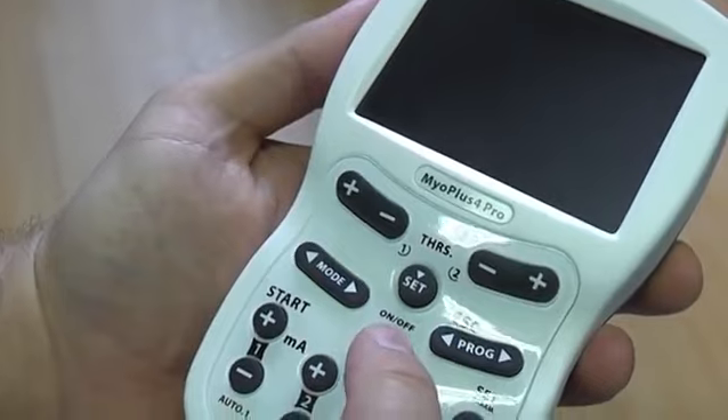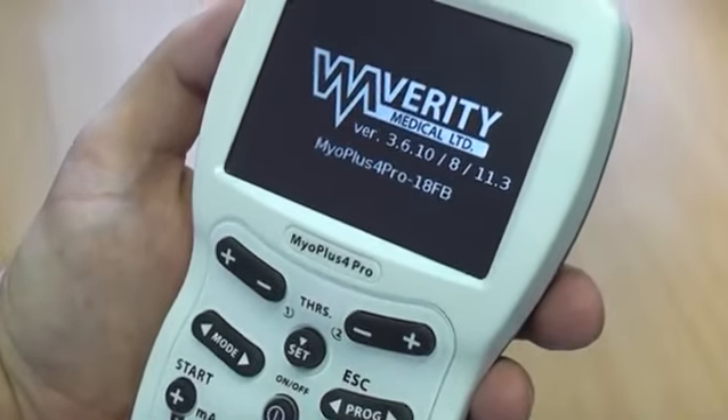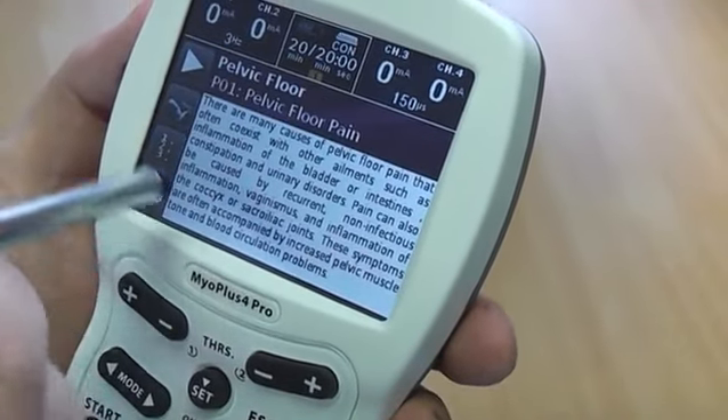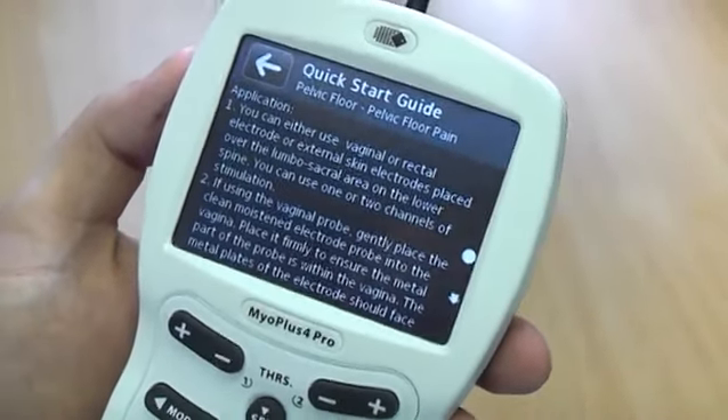Now it is time to power on your unit. This model has a full colour graphics screen which allows you not only to visualise the treatment in a most user friendly way, but also to display pictures and video tutorials so you can always know where you are and how to use your selected treatment program.